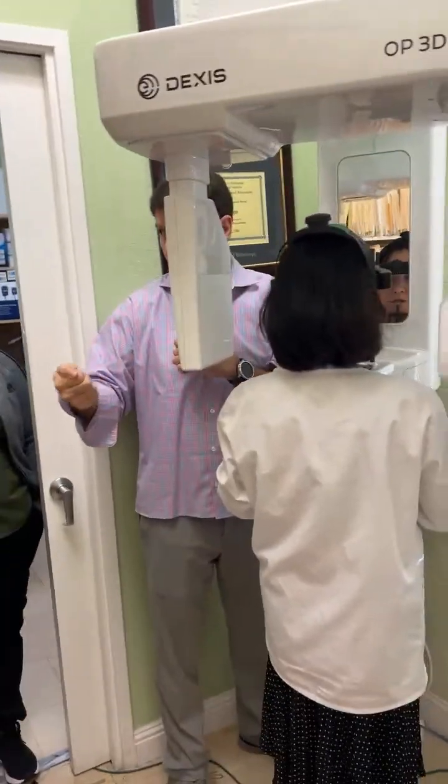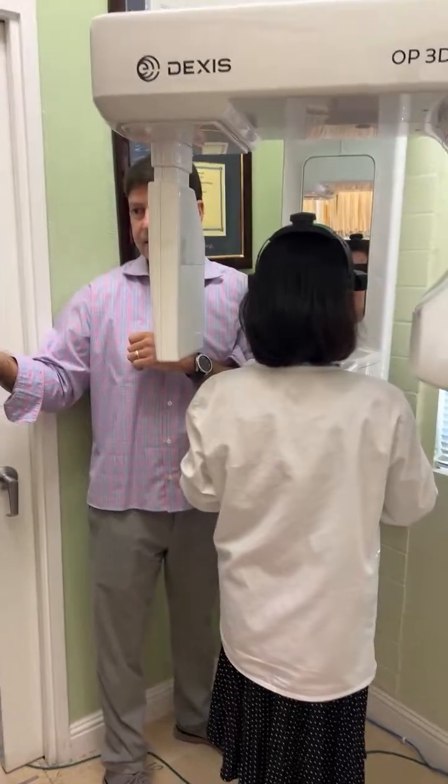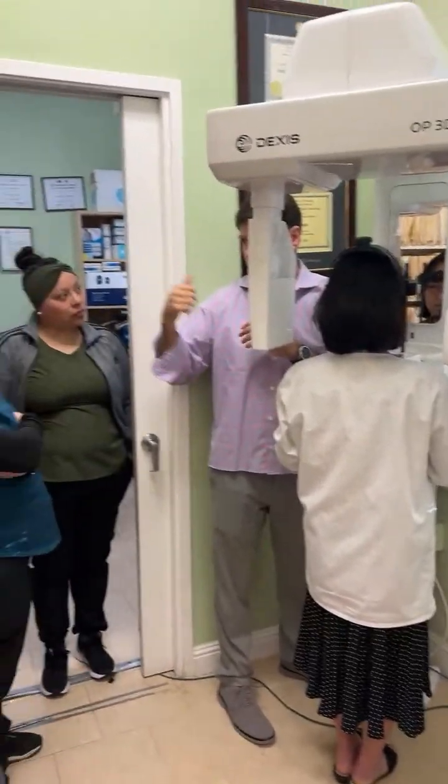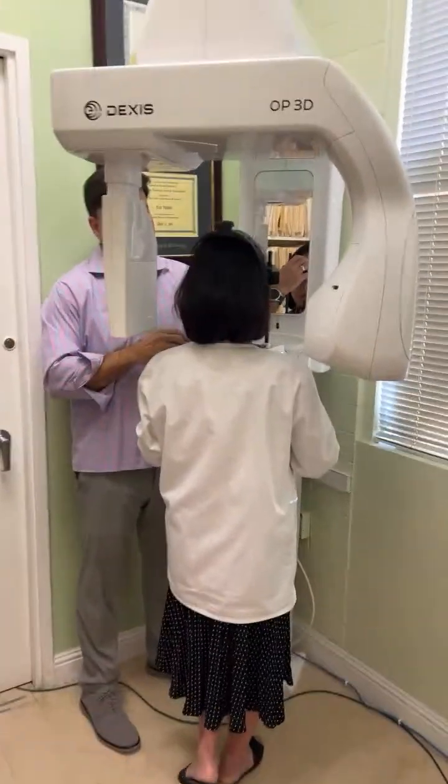Now you're going to hold this for about 12 seconds. It's going to go around and then it's done. Chime at the end and let go. Okay.